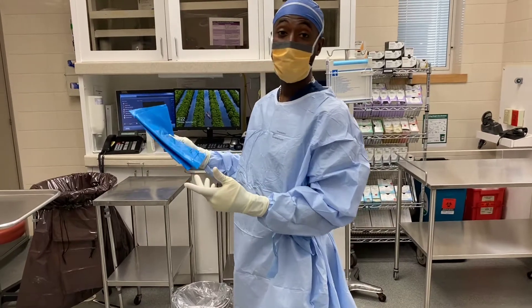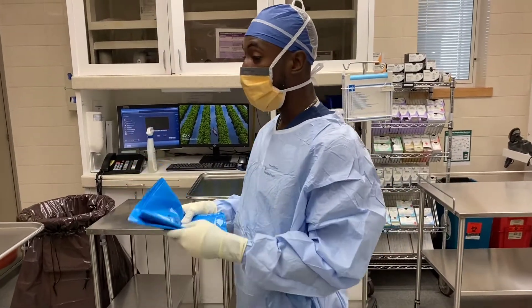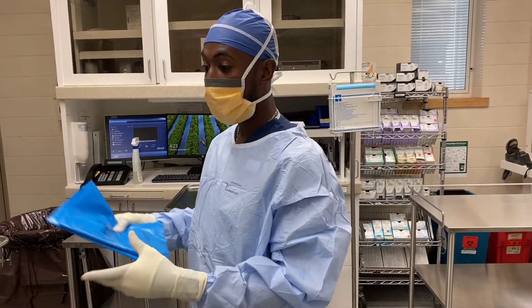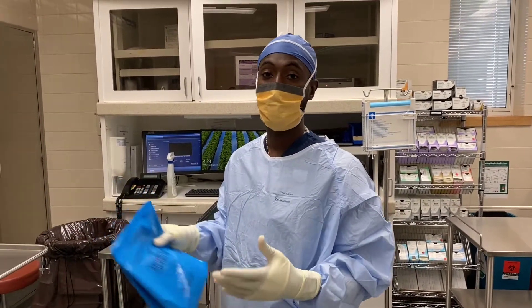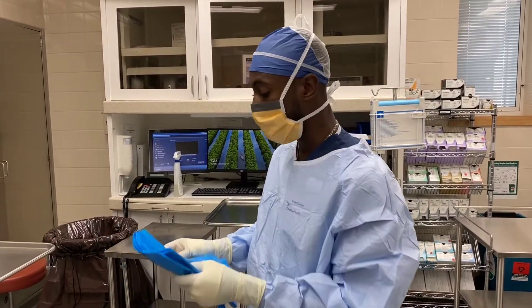So let's say that your mayo stand cover came in your back table pack and you grab it out of there, or your nurse could have opened it up separately depending on your supplies at your hospital.